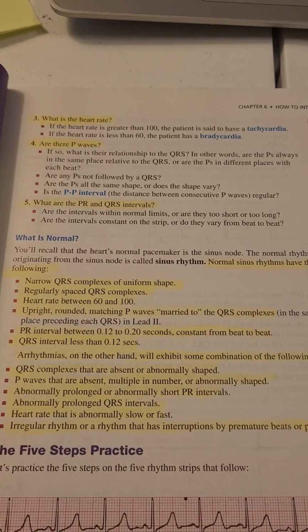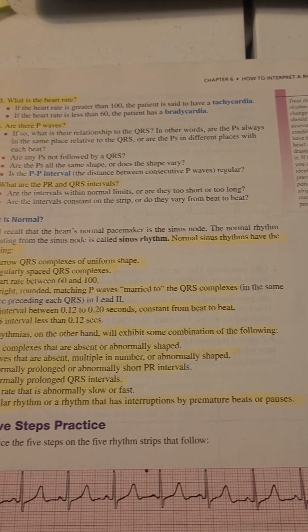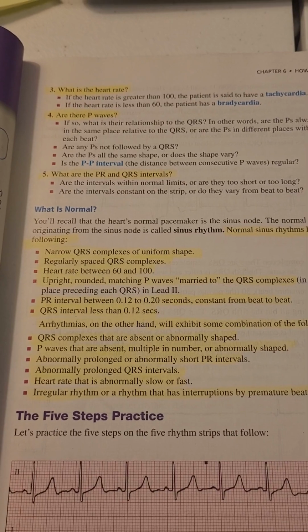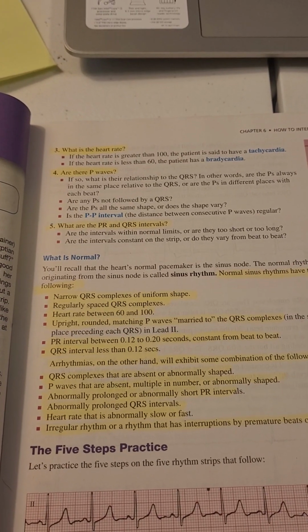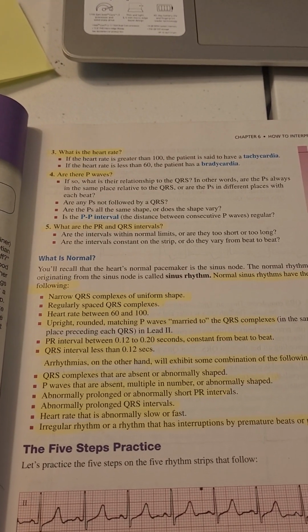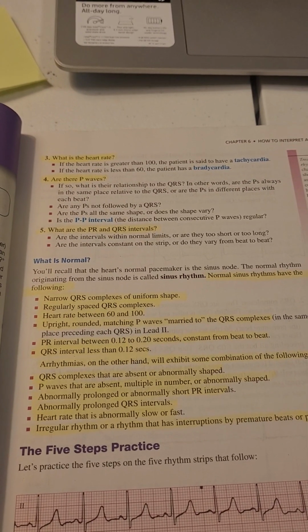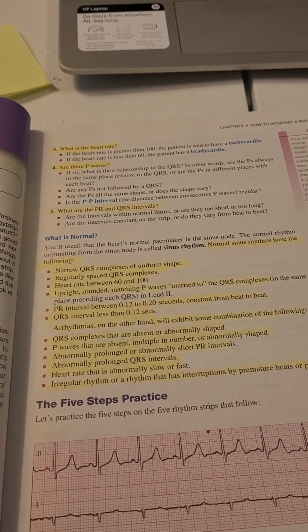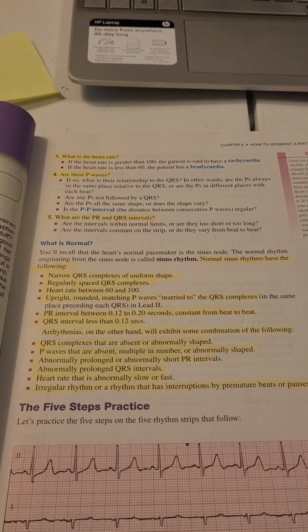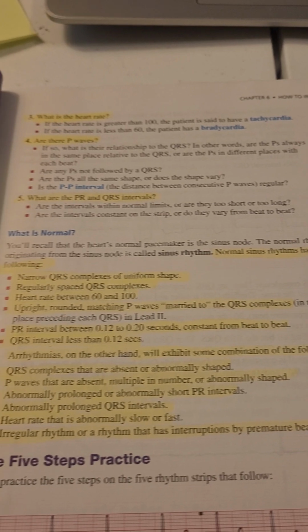So it says, you'll recall that the heart's normal pacemaker is the sinus node. The normal rhythm originating from the sinus node is called sinus rhythm. Like I said before, and I'm going to keep saying, the majority of the heart rhythms that you'll see are normal sinus rhythm. And some might be sinus rhythm, but they might have PVCs, PACs, pauses, or other things going on. So it's not like one rhythm and that's it. It would be good if each rhythm was just sinus rhythm and that's it, but sometimes it says sinus rhythm with something else.